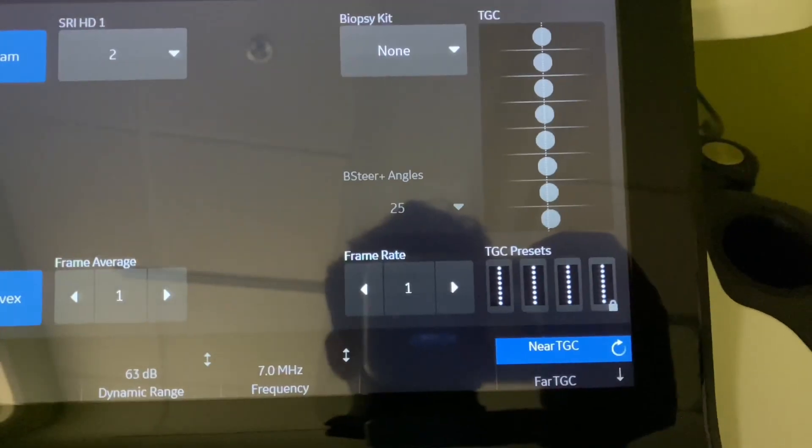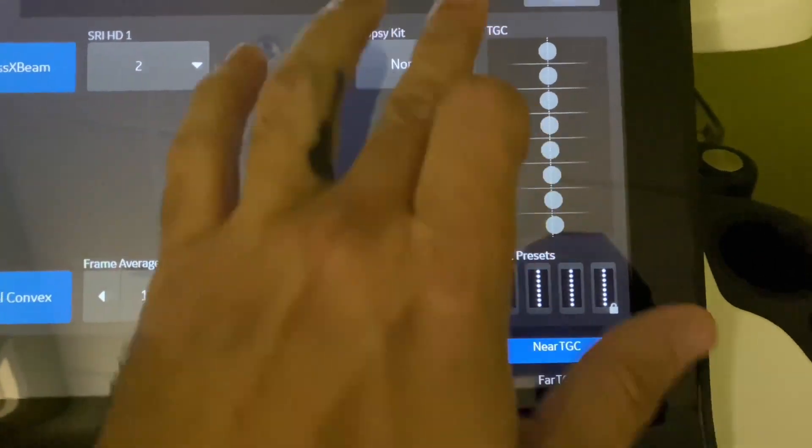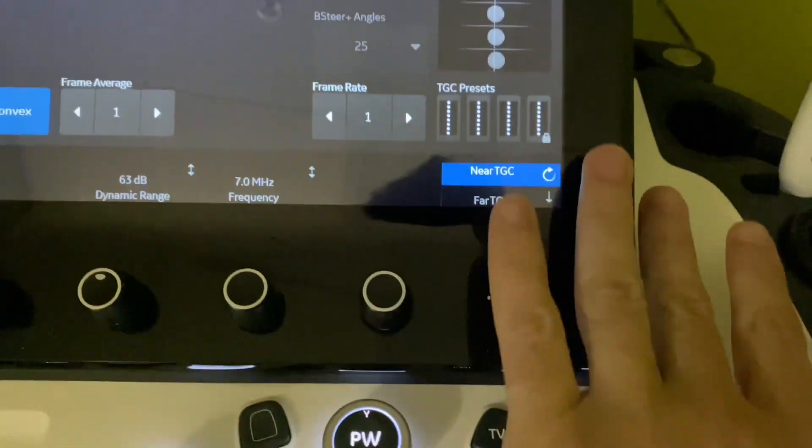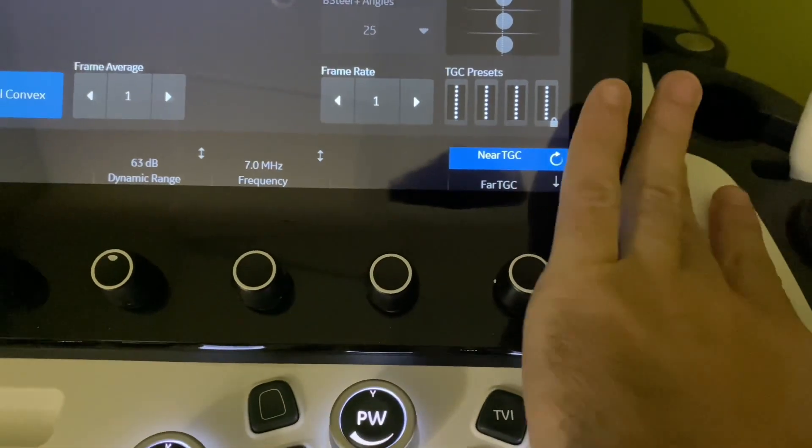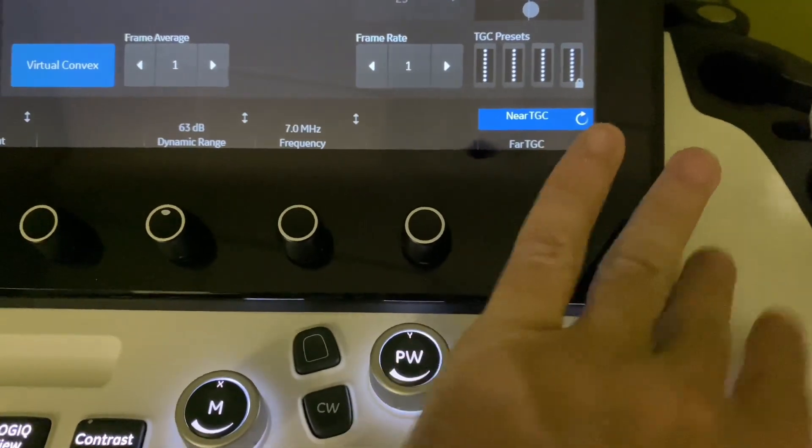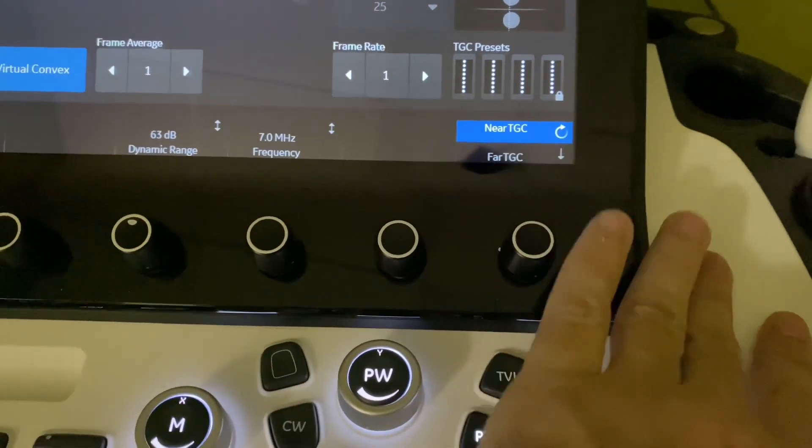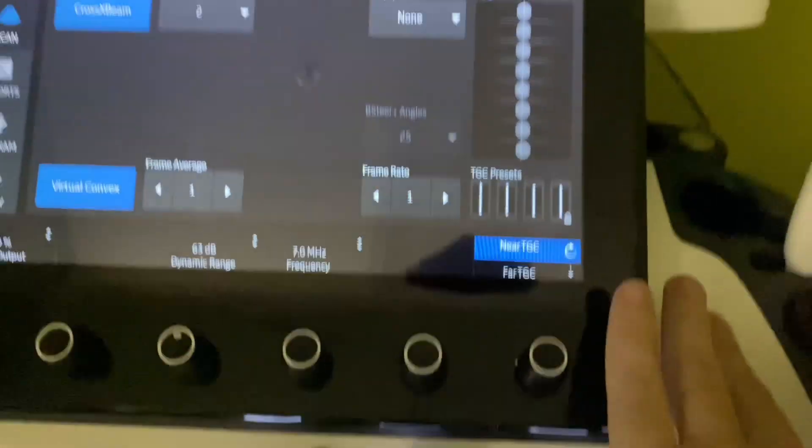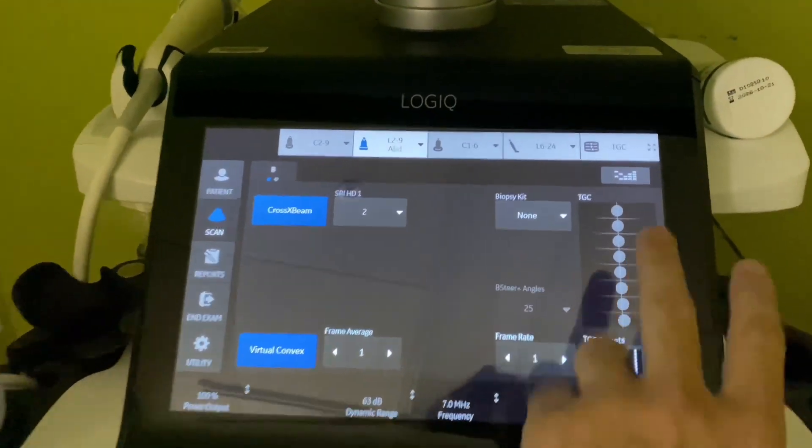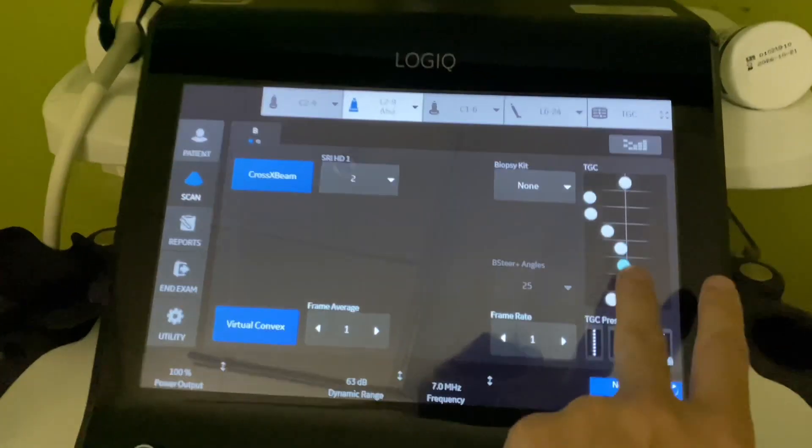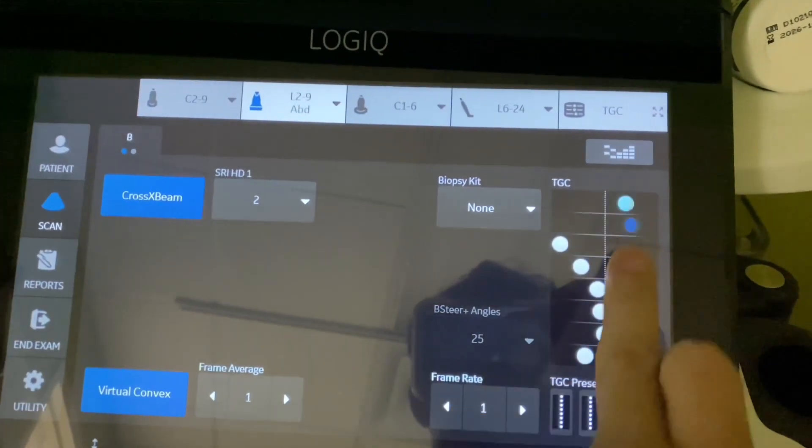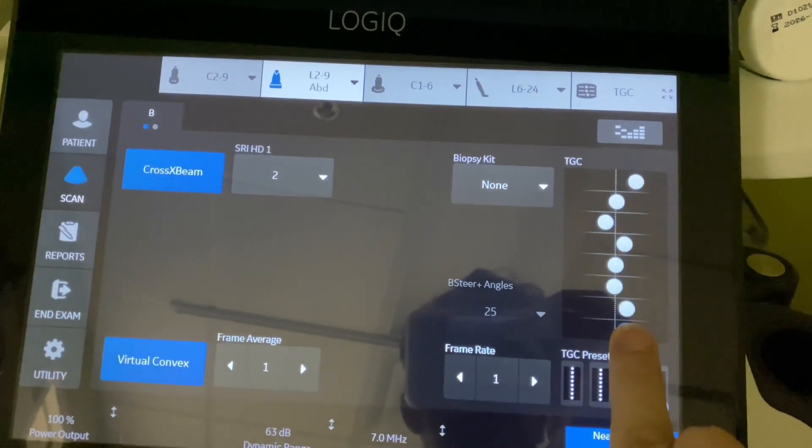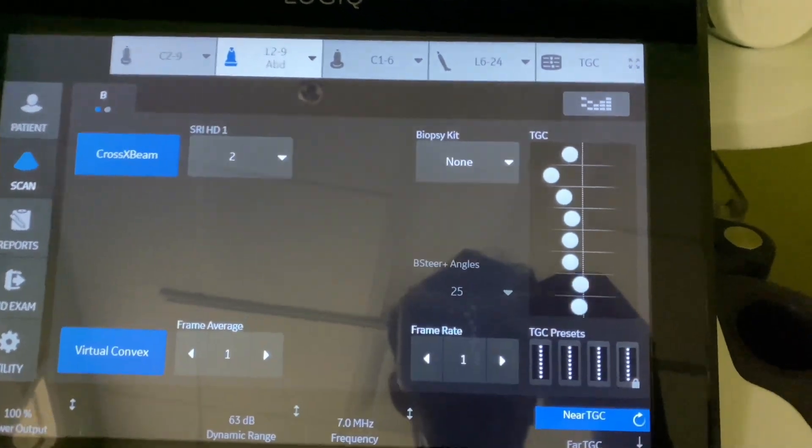One thing that I think they've actually added intuitively is usually when you're using the TGCs, you kind of will do motions like this. That's pretty much how I use it, although I do a lot more fine tuning. I don't know if you can do that here. Oh, actually you can. All right, so that's not that bad. That's not that bad. That's pretty much how I use it intuitively.